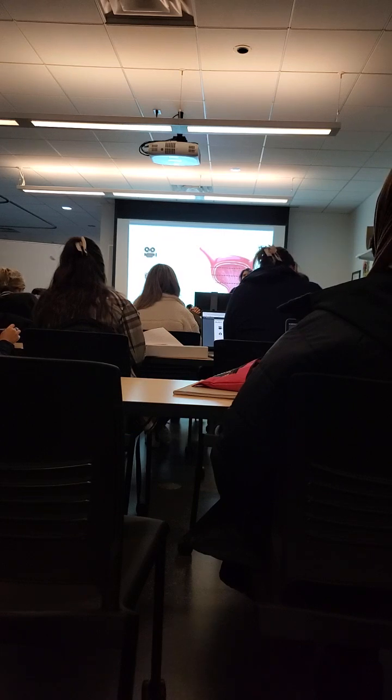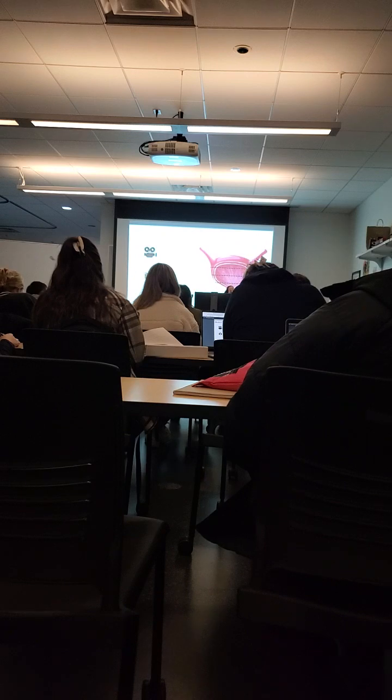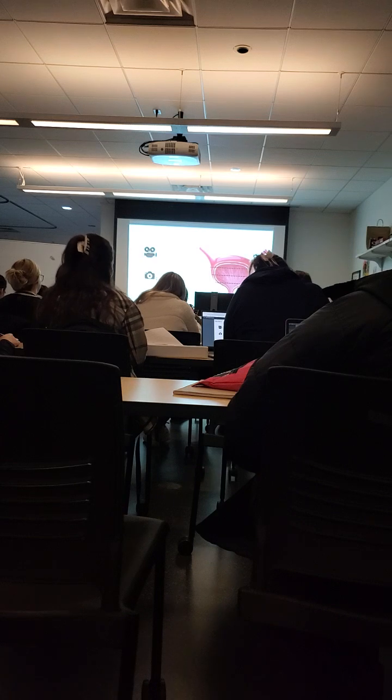Why can't we put color right away? Why does it have to come back? I always like to get my images first, because sometimes it takes a while for the ureters to work. They become really shy when they get scanned. So you want to make sure that you can sit there for 5 whole minutes, and that's what you have to do. If you can't get ureters, you need to prove.